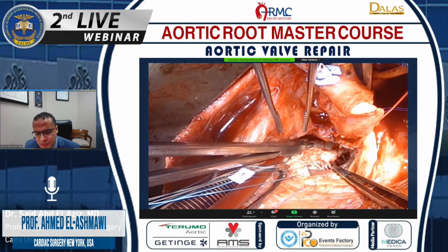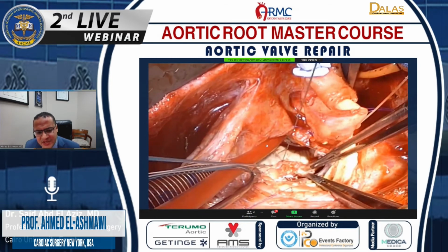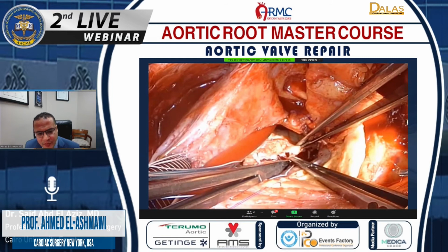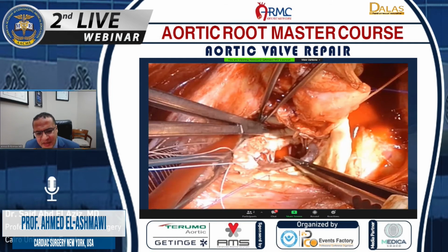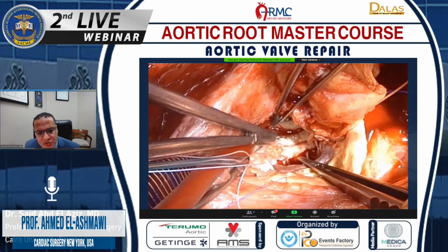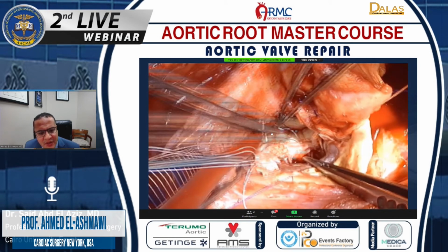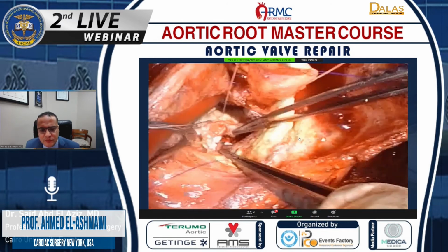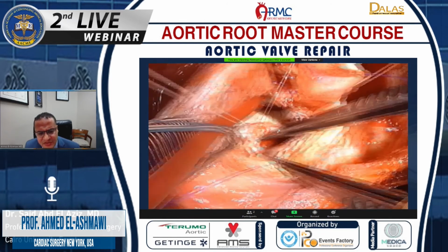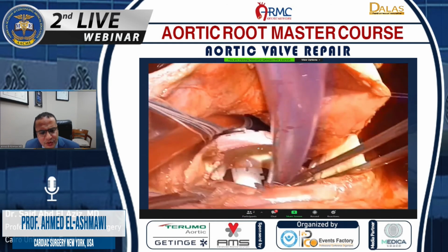You have to use a big SH needle and basically bounce behind the shoulder of the calcium bar. Not too deep at the P1, P2 area, because you don't want to get the circumflex in the suture line, and also to avoid deep muscular sutures, which can be a cause for AV groove disruption. The mitral valve is lowered into position, and then the sutures are tied.